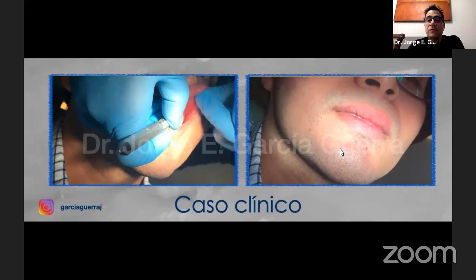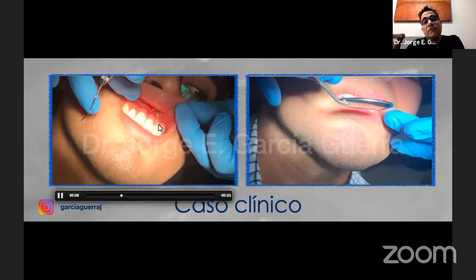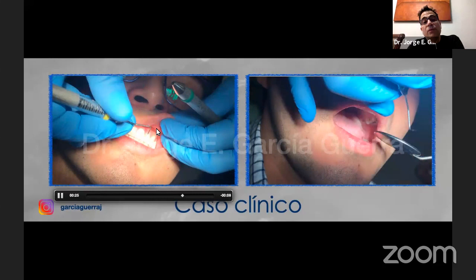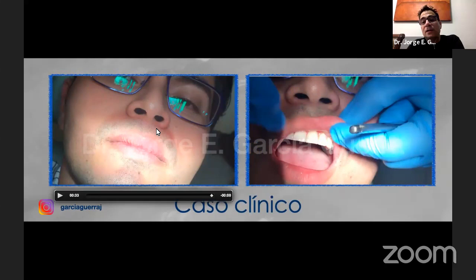As you see in the left video, we're marking the tissue with our instrument, so we can imagine where the roots are. We mark it just where we have the mucogingival junction. Probably prior to that, we put some anesthesia. So we mark the tissue so we can insert the mini implant better. Now on the right video, we already marked the tissue, and it already had the anesthesia.